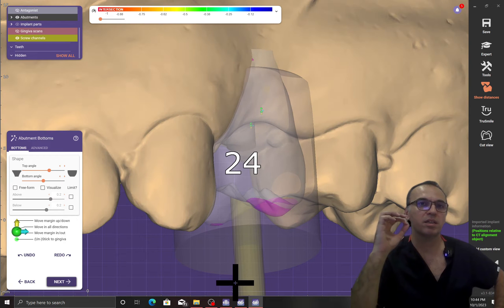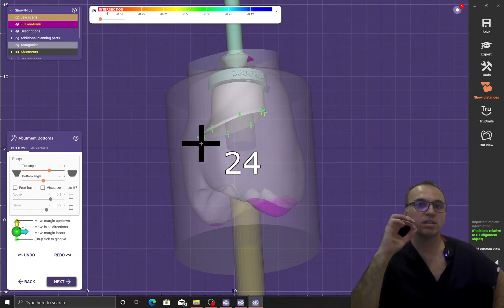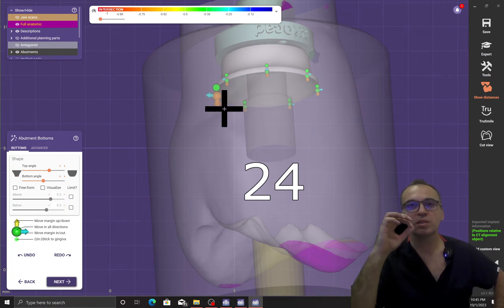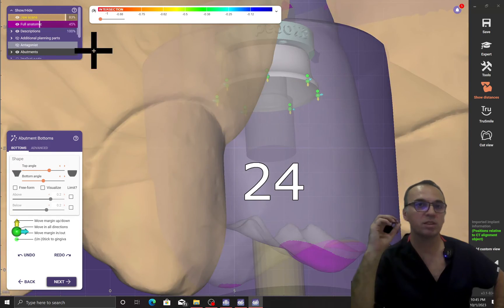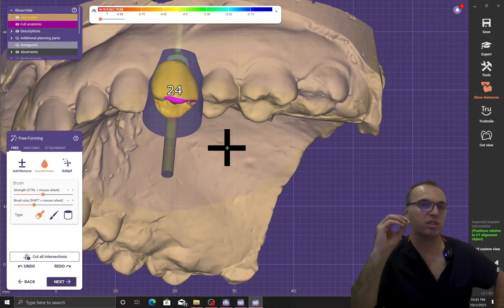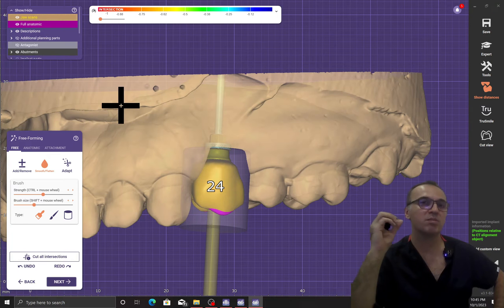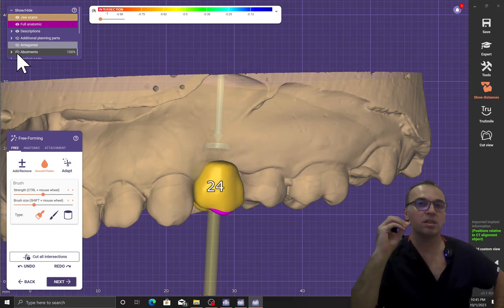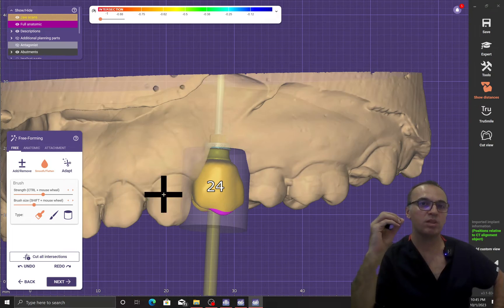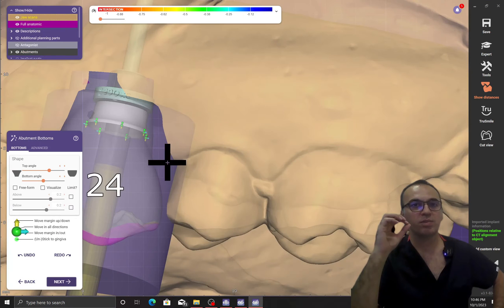Don't use special shapes in your custom abutment — it should be round and symmetrical. Why should it be symmetrical? Because if you make a customized formed abutment, it should sit exactly the same as you designed.